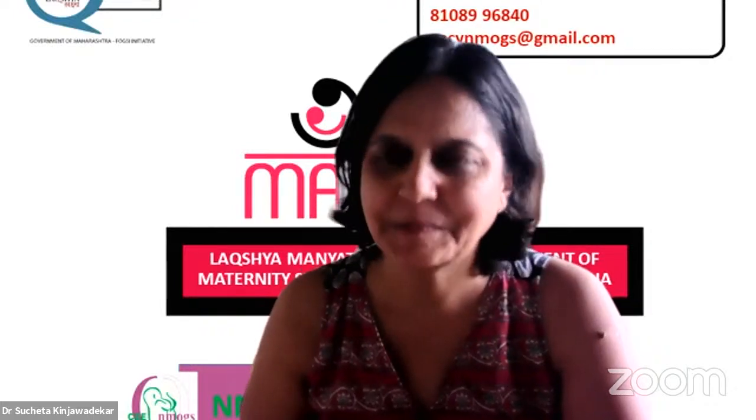Thank you, ma'am. And also it is very important to measure it twice, to make at least a total of 4 measurements, right? Yeah. Okay, thank you very much.